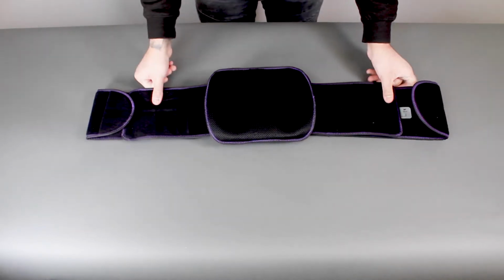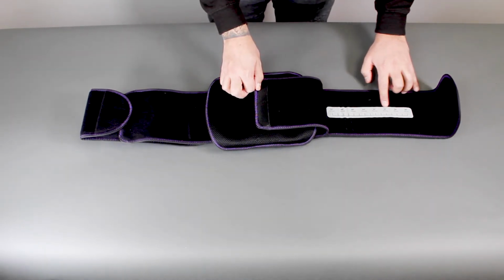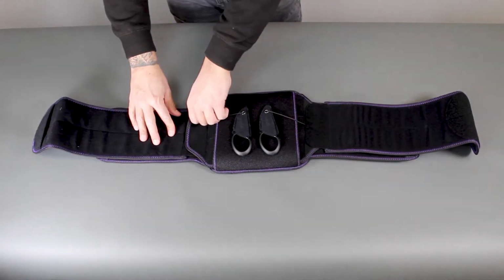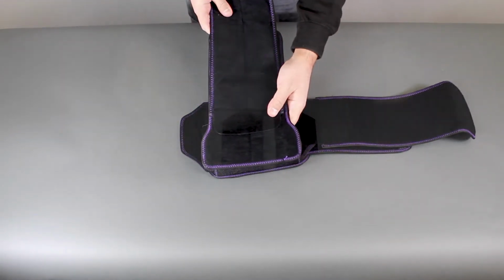The compression belt is designed with pull tabs and can easily be sized to meet the patient's specific measurements. On the inside of the belt you can see a measuring chart. From here you adjust the belt position to your desired length. If your patient has a waist under 34 inches, you will need to remove the extension pieces and swap them with the small hook and loop adaptations included in the bag.